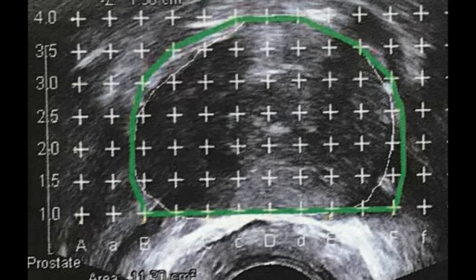It's also been used for many years to guide implant procedures. A classic example being prostate brachytherapy, where you have a probe that you can visualize the prostate, and then you insert seeds as you're visualizing it with the ultrasound. So it's important to understand this modality at some level, and so hopefully this video will provide you with some basics. Here we go.